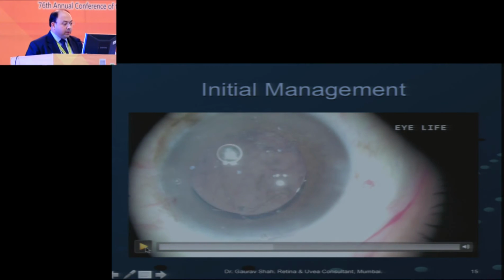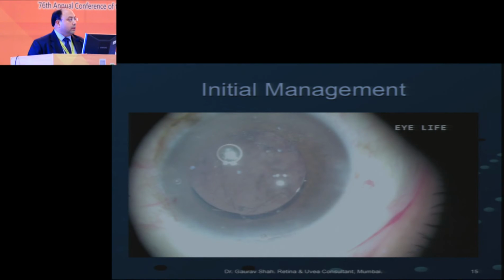One thing to remember is always dilute your triamcinolone. There have been times initially when we learnt about the use of triamcinolone, we used to inject it undiluted. It used to become a dark blob of white color. We cannot see what structures are behind it, and even if some amount is left behind, and if the patient is a steroid responder, then post-operatively they have a huge IOP spike. So I usually dilute triamcinolone 1:5 before injecting it into the eye.